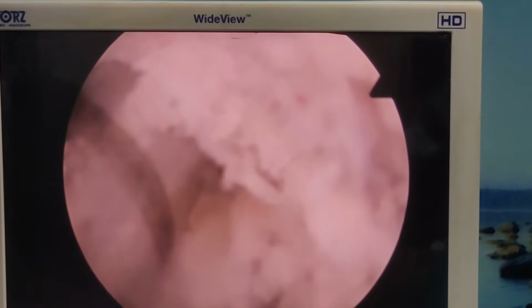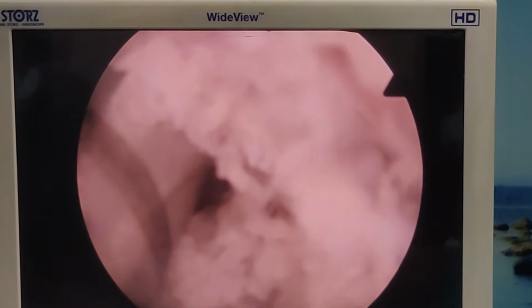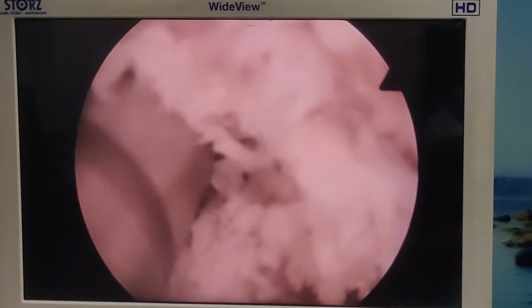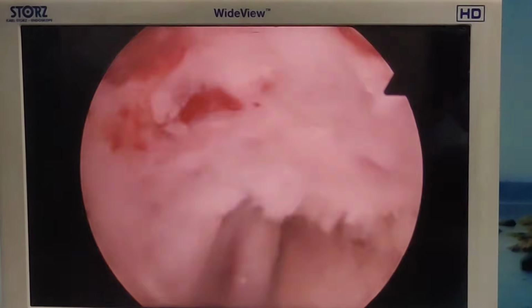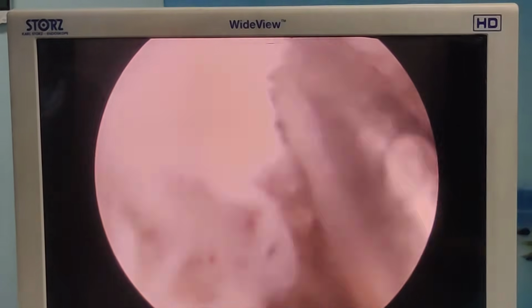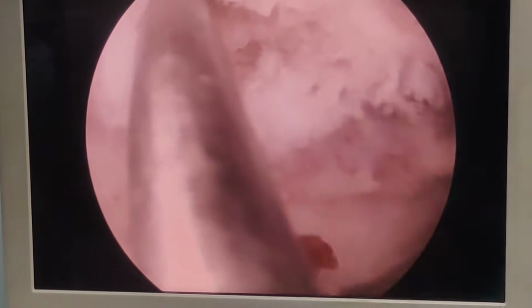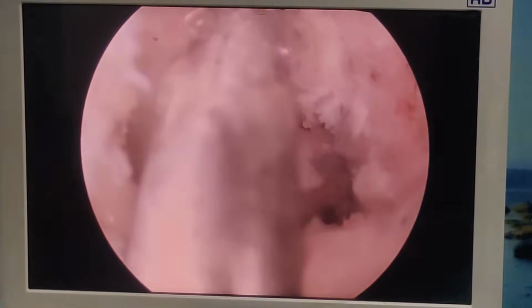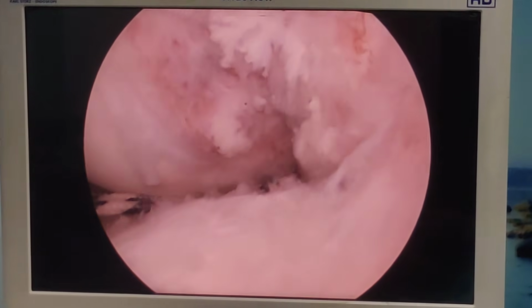But that's fine. We deal with poor patients and we have to make them better, and this challenge is nothing when you get the reward when they do very well after the surgery. So it's okay. So this is our tunnel done. So I can show you right within the tunnel. So once the tunnel is done, then we need to pass another suture, and I will show you how.